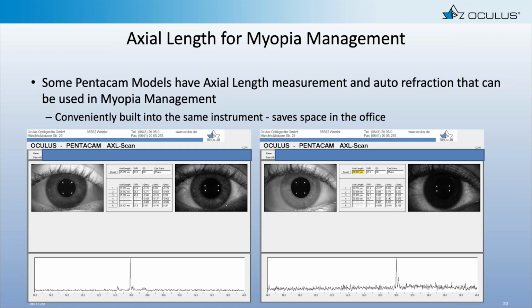The picture on the left, this is done through a typical walkthrough where I can get axial length measurements, wavefront aberrometry, and corneal tomography and/or scleral topography all through one series of measurements that's all done consecutively, one right after the other in order.